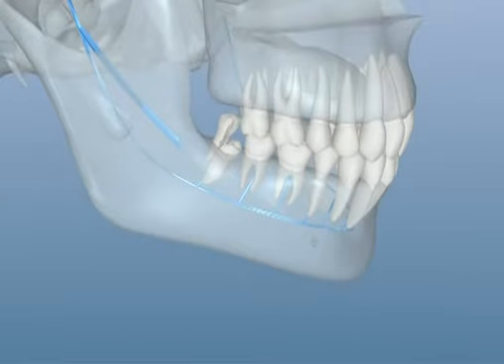Nothing right now. Another complication associated with surgery in the lower jaw is the possibility of nerve damage. The surgical site is usually very close to several sensory nerves that run through the jawbone. This nerve can be injured during lower jaw surgery, leaving patients with pain or tingling or a numb sensation in their lip, chin, gums, teeth, or in some cases their tongue. This sensation, which is similar to the effects of Novocaine, can last for days, weeks, or months, and in rare cases, the condition is permanent.